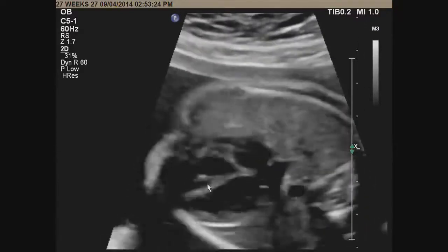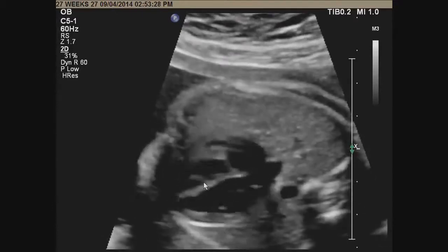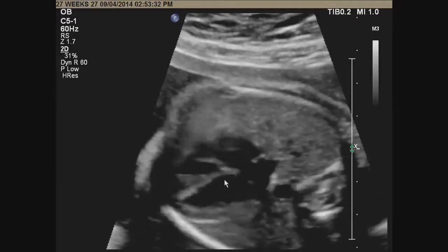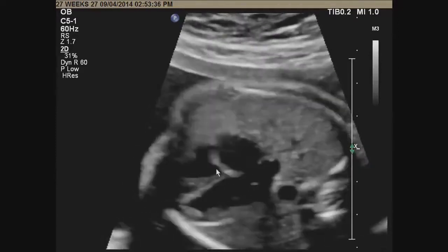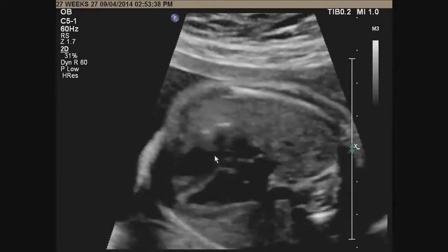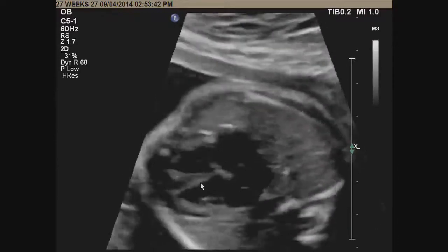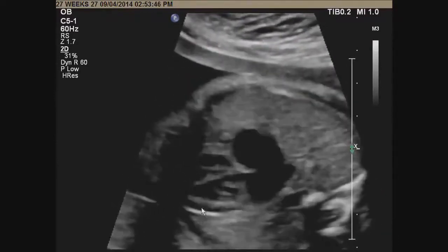There's septal insertion of the chordae tendineae in the right ventricle, a feature that is not available in the left. All the cords that come from the mitral valve insert into the 2 papillary muscles in the left side, whereas in the right side, as you know, there are 3 papillary muscles, but there are some free cords that insert into the wall. This becomes important if you're trying to determine situs of ventricle. So I'm going to come in a little bit at an angle.